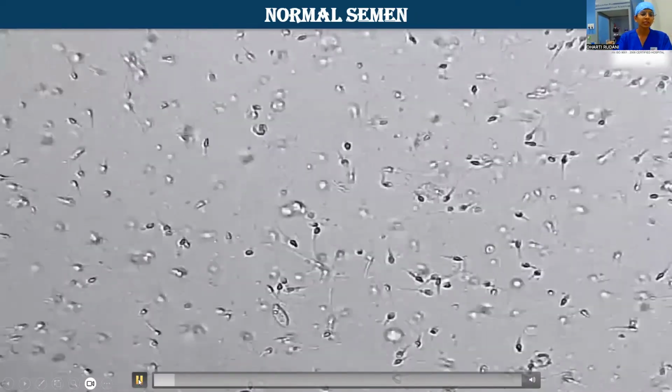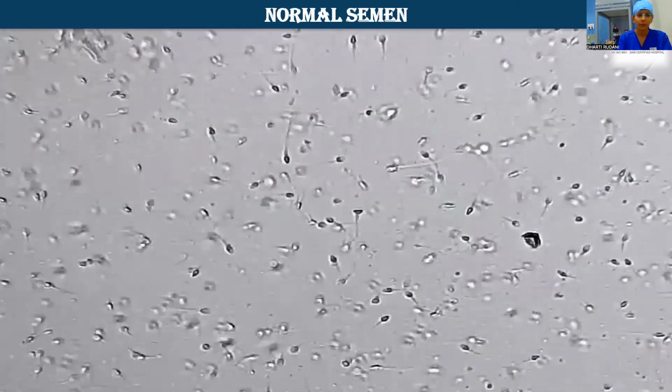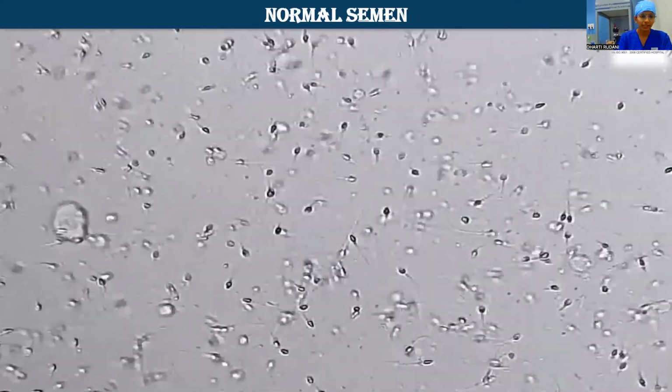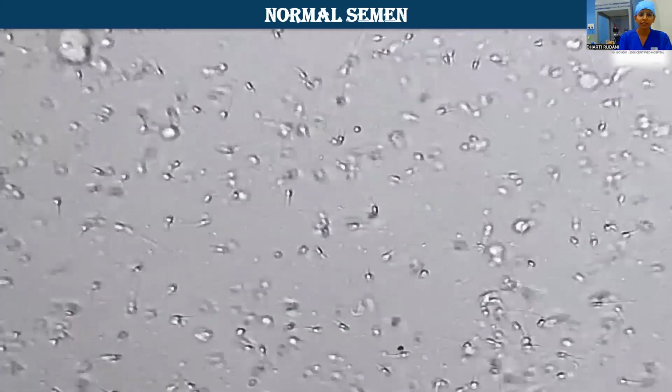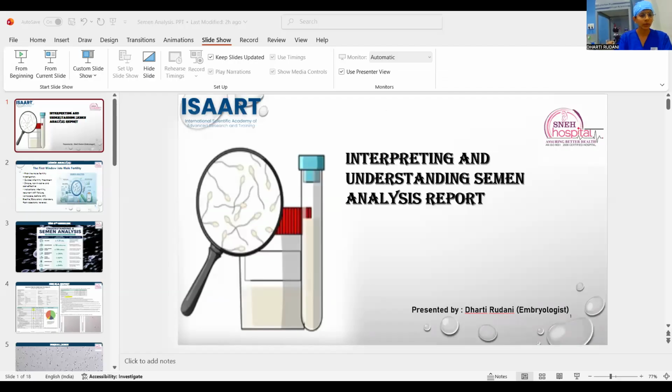This video demonstrates a normal semen sample. Notice the high sperm concentration with rapid progressive motility, features that are generally associated with good fertilization potential. This report represents oligoasthenoteratospermia, where sperm count, motility, and morphology are all compromised.